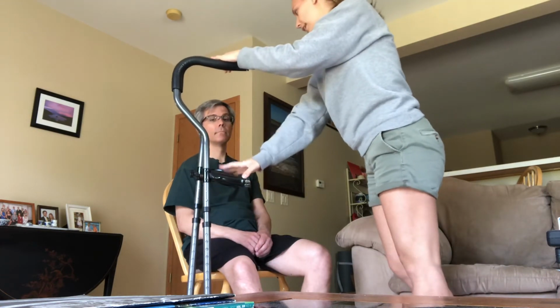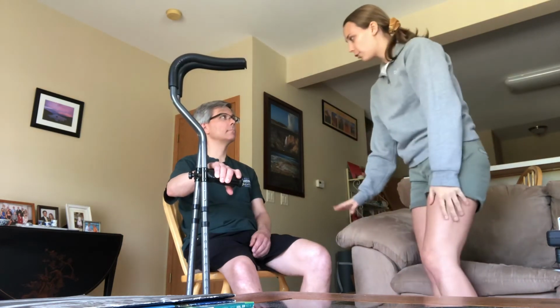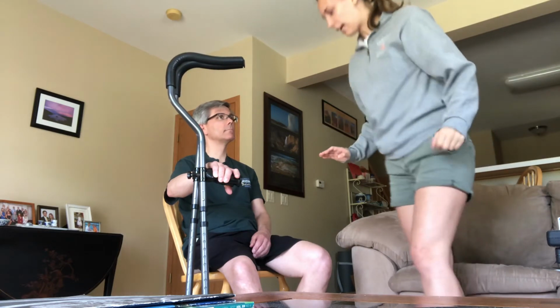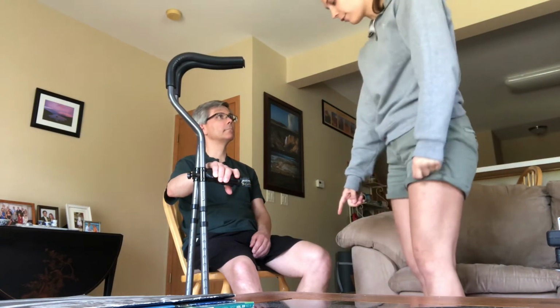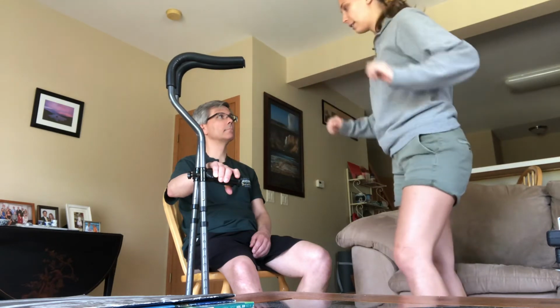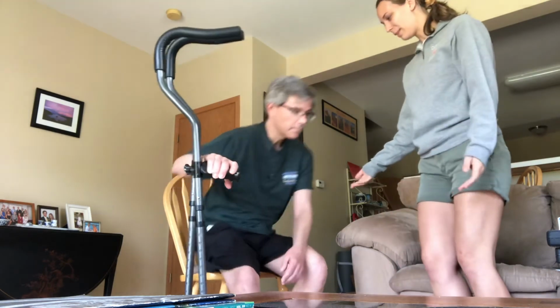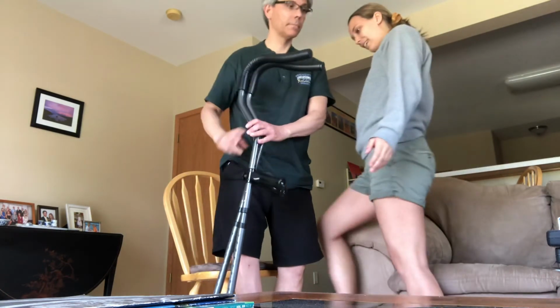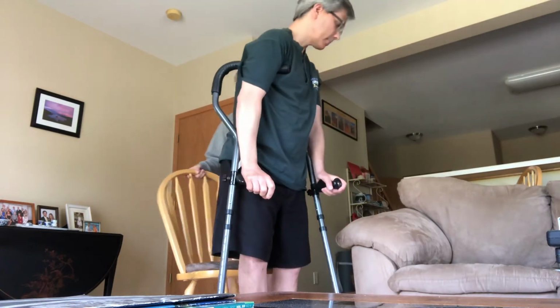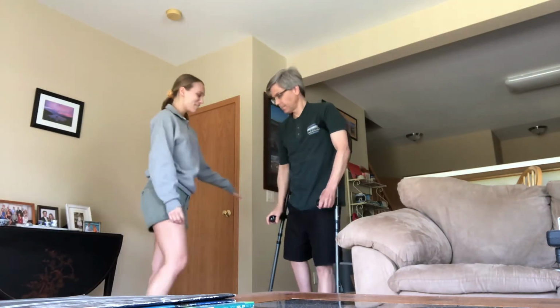I'm going to have you place your right hand over here, and then if need be, there is a little bit of a cushion here for you to push up on with your left hand if you feel the need to. But you're going to be getting out of the chair, pushing through with your left, which, perfect, it's underneath your knee very well, and you'll be using your right hand to push off of the chair. Does that make sense? Yes. Okay, sounds good. So if you want to try that for me. Okay, perfect. Yep, and then so these go under the armpits and then hands right there. Perfect. So I'll be moving this out of the way really quick. So then yes, we'll just be back here.